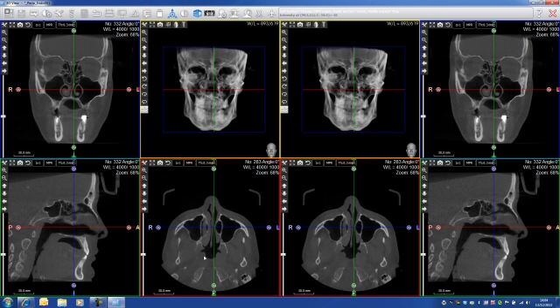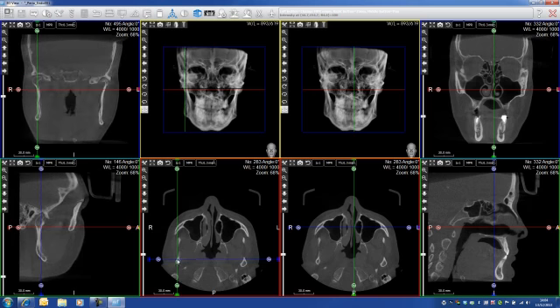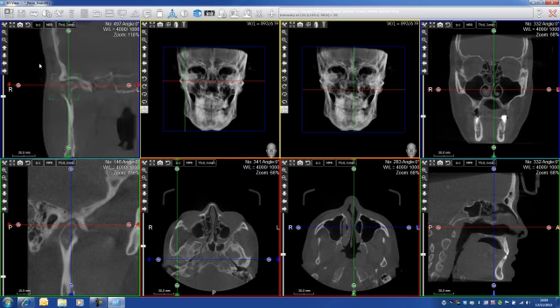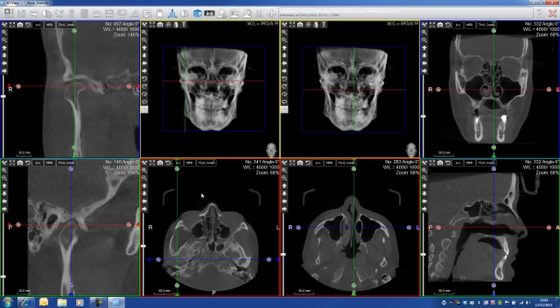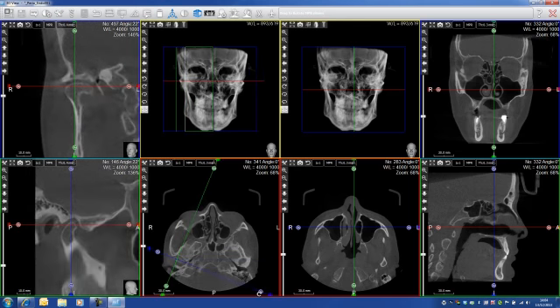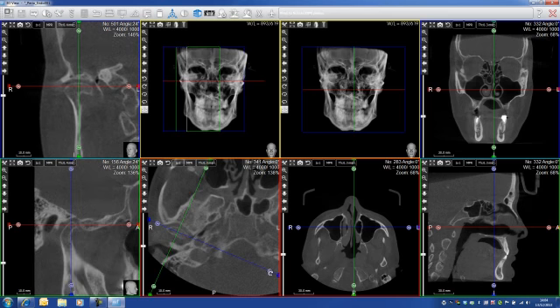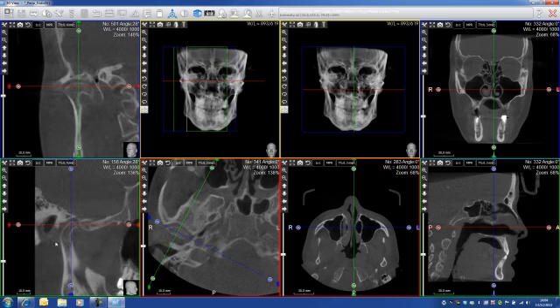The idea here is to actually visualize both condyles in a symmetrical way. So I go on the right TMJ, I always left click, I zoom in, and the idea is to use the blue line to get parallel to the TMJ. I zoom a little bit more — now I'm well parallel to the TMJ, and I can see my TMJ appearing here.